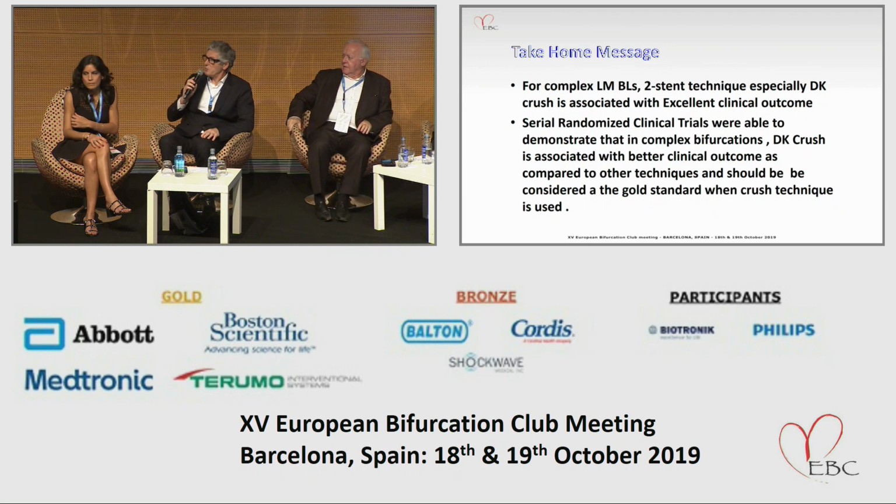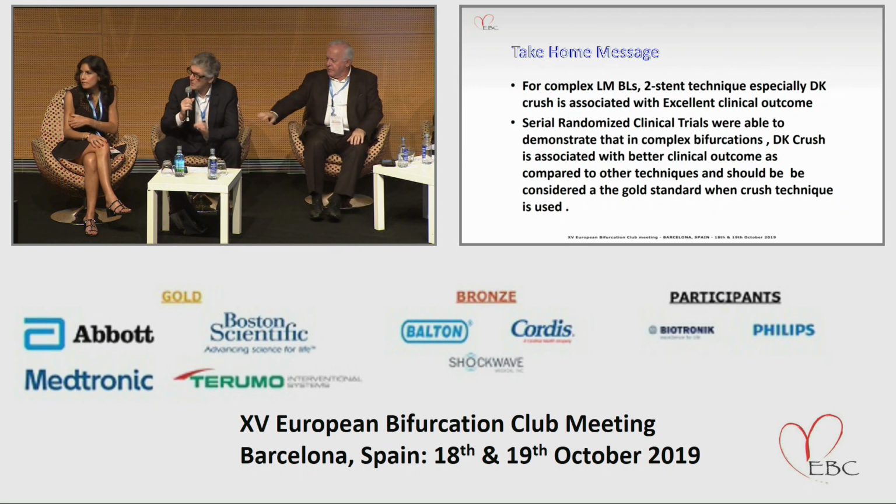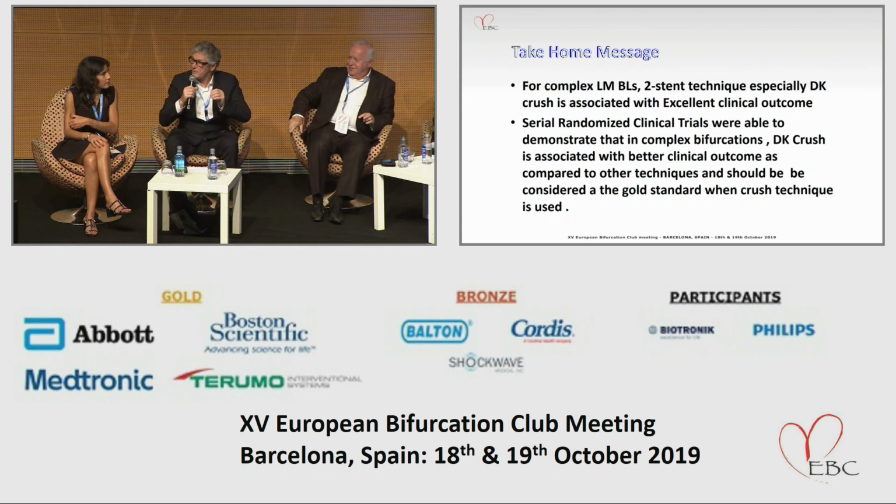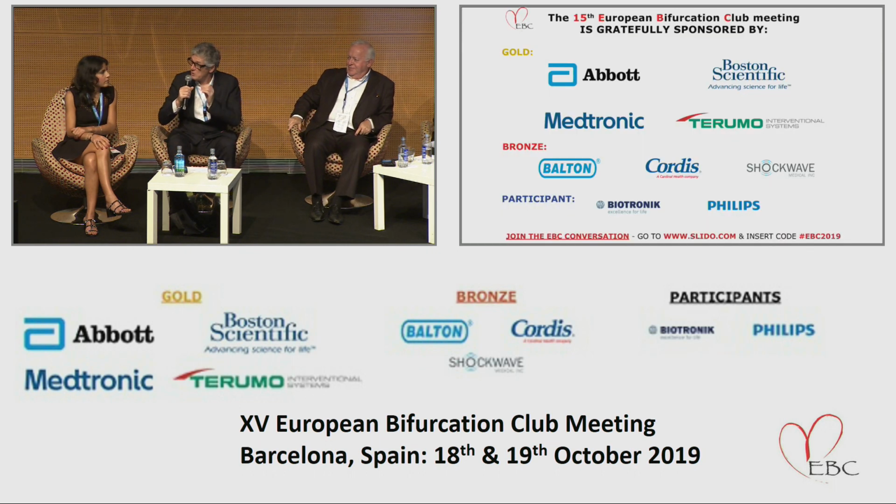Thank you very much. So the question is, if you use a DK crush, I know. If you use a crush, it should be a DK crush. So the next presenter will say, no, sometimes I use a crush, and not a DK crush. So it's not to compare to other techniques, it's to compare DK crush to crush.